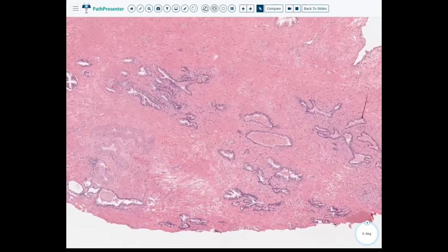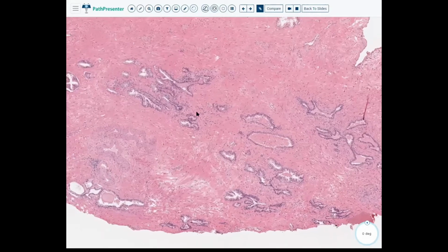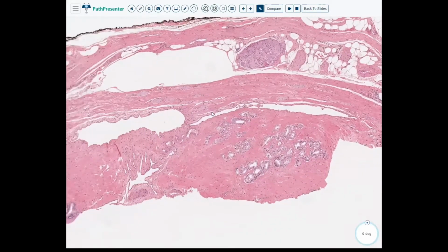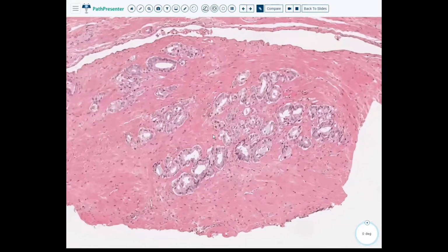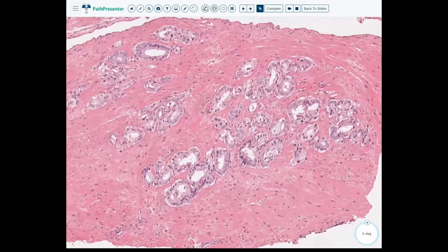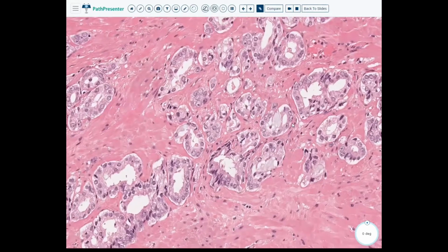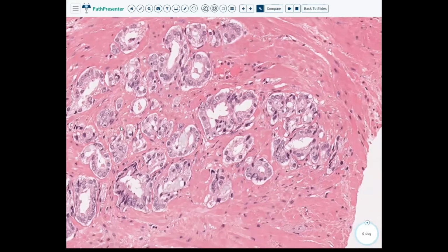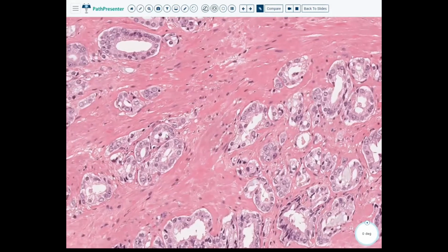And what we see here is a little bit of atrophy where glands are angled. Atrophy itself is not malignant. We do have things like this, okay, where we have very small, poorly formed glands. Really not appreciating that dual layer, right? Looks like one layer. And nucleoli aren't always helpful with this, but if you see multiple, they tend to be at the periphery, not centrally located.